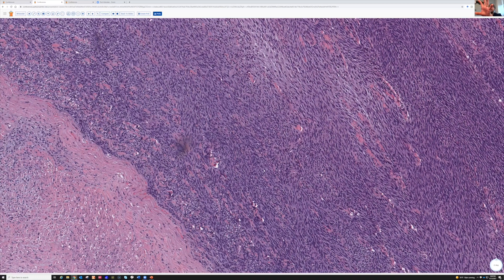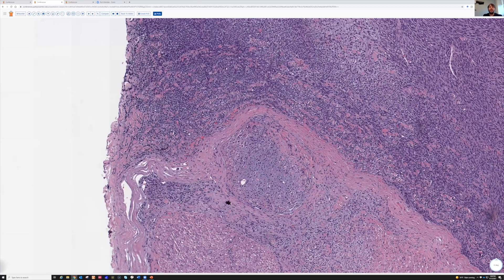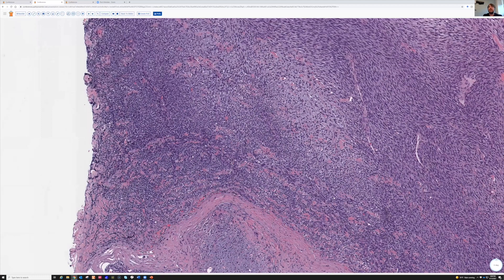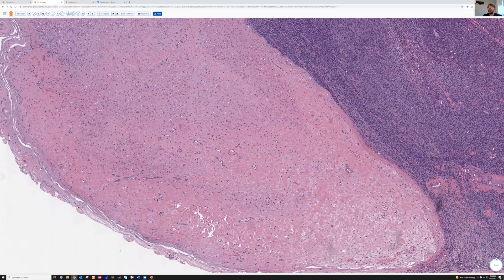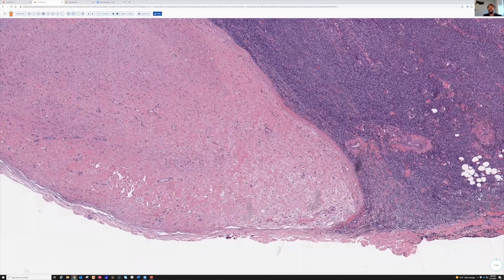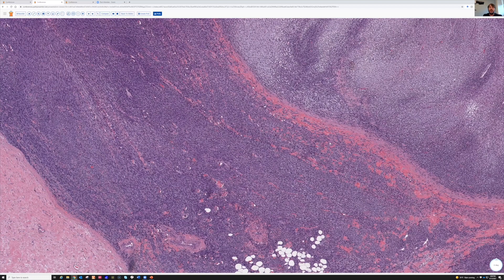This tumor was actually growing out of the nerve, and there is also a neurofibroma in another section. It was growing out of the plexiform neurofibroma, and this patient did indeed have neurofibromatosis type 1, unfortunately. This is a bad high-grade sarcoma that unfortunately afflicts a significant subset of patients with NF1 — one of the many reasons NF1 is a very serious diagnosis. This is why you should be very cautious about making a diagnosis of plexiform neurofibroma.